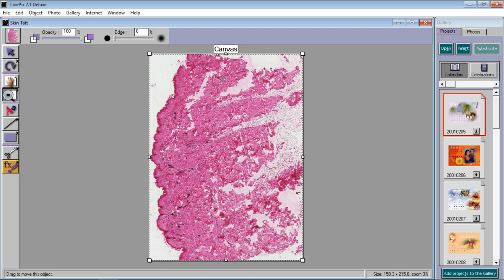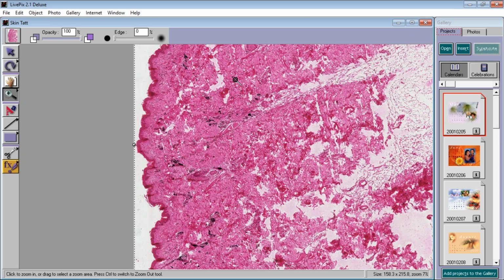Now notice this. When you look at the skin here, it does not look like the skin is entirely black. You just see stippled black particles here and here and here and here, even though you just see tiny little black specks. If you were to look at the skin on the person, it would look black. If it was a person with white skin, it would look black, okay? Or maybe they would inject red particles or green particles. So this is what they call an exogenous pigment being chewed up by macrophages, okay?